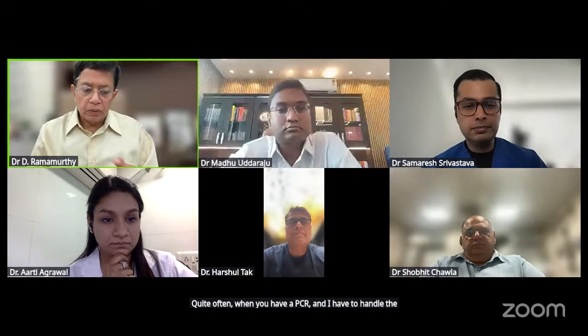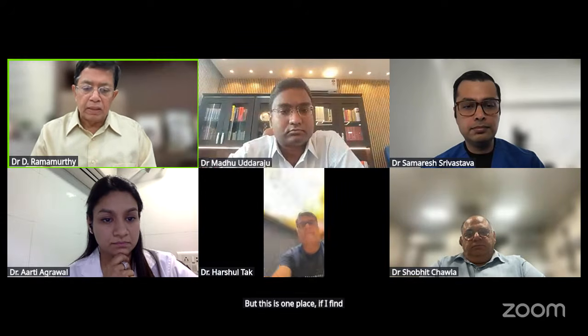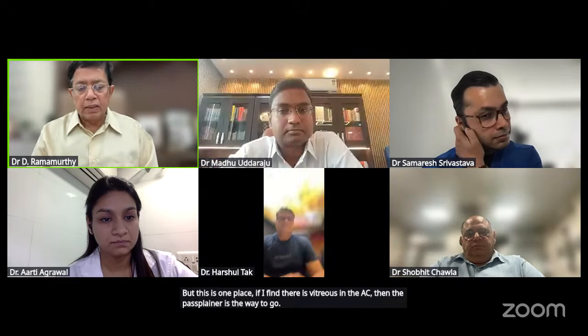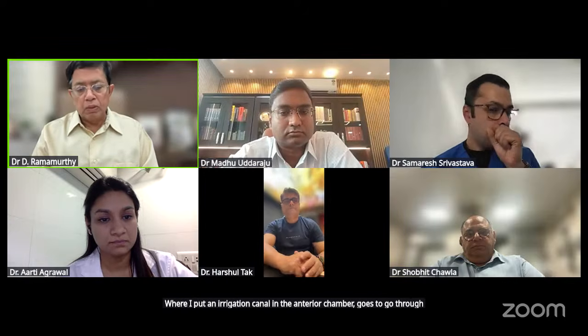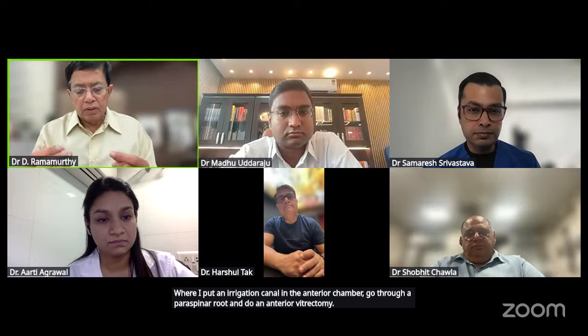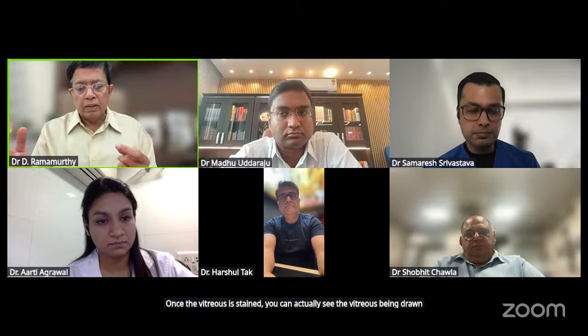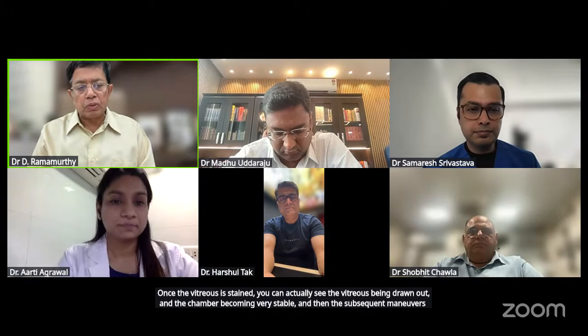vitreous, I go through the anterior route. But this is one place, if I find there is vitreous in the AC, then pars plana is the way to go, where I put an irrigation cannula in the anterior chamber, go through a pars plana route and do an anterior vitrectomy. Once the vitreous is stained, you can actually see the vitreous being drawn out and the chamber becoming very stable, and then the subsequent maneuvers become so much more controlled.